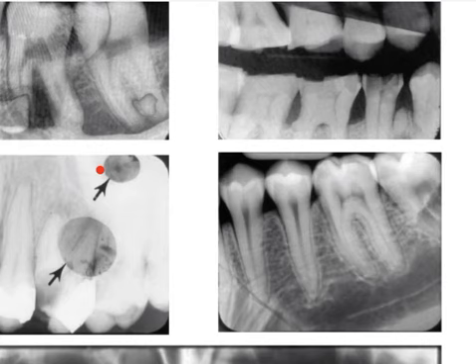This is because of developer contamination just before the processing was started. Okay, developer contamination just before the processing was started. So these are the reasons why you get to see these kind of errors.